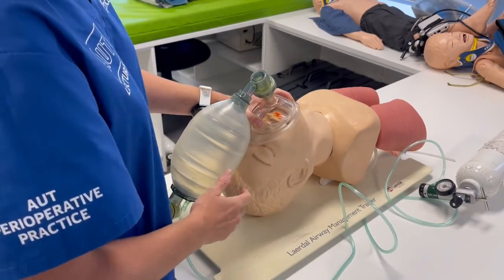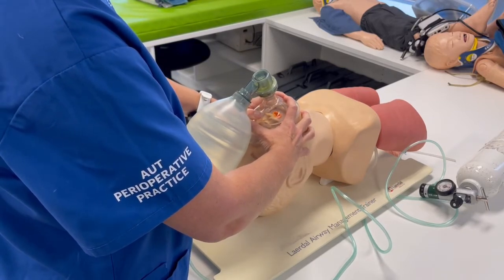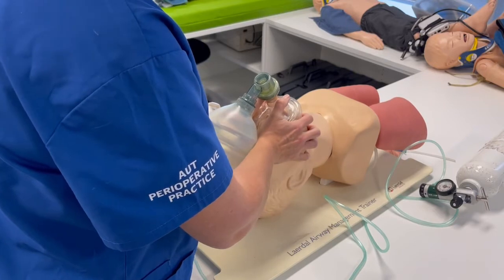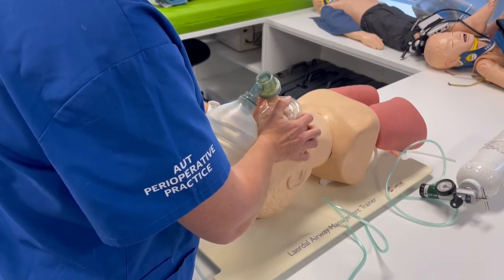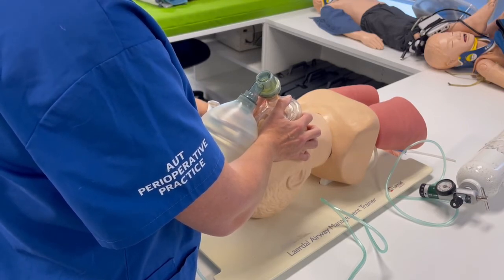For the two-hand technique, you can either do a C-E grip with both hands and have a second person squeeze the bag, or you can use what we call the vice grip — most of your fingers on the mandible with your thumbs holding the mask onto the face. This is also a two-person technique as someone is needed to squeeze the bag.